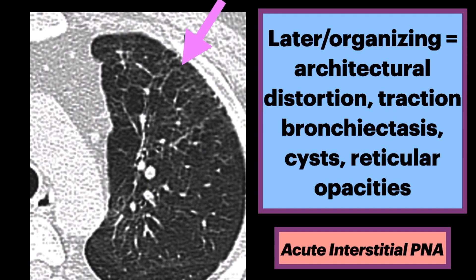Here is an axial CT of a patient three months after the acute phase. This is now the late phase, and there is evolution of the lung opacities to areas of reticulation. Areas of fibrosis tend to involve the non-dependent regions of the lung, which are thought to suffer more from barotrauma than the posterior previously consolidated areas.